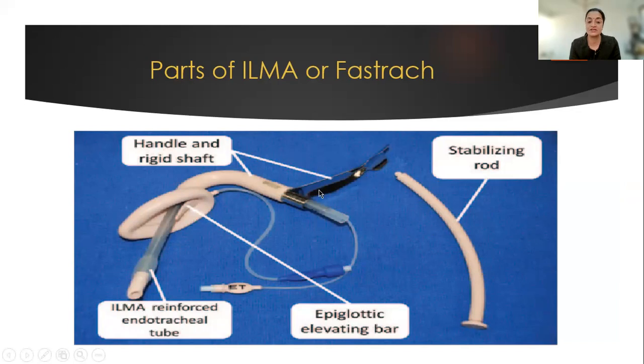This is a first generation supraglottic airway device which comes with a handle or a rigid shaft, a prefixed curvature. There is an epiglottic elevating bar, pushing which the reinforced endotracheal tube — or the flexiometallic endotracheal tube that comes with the set — comes out of.